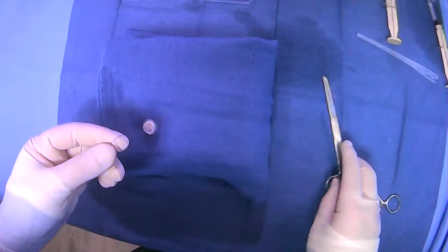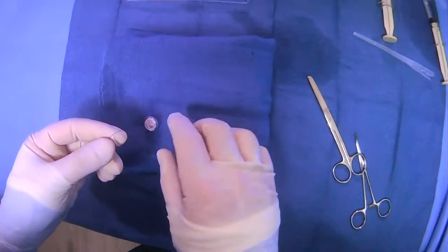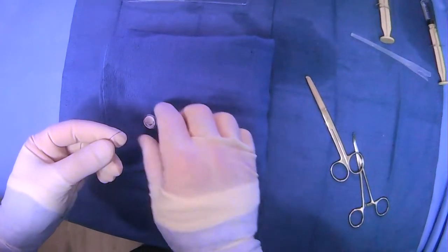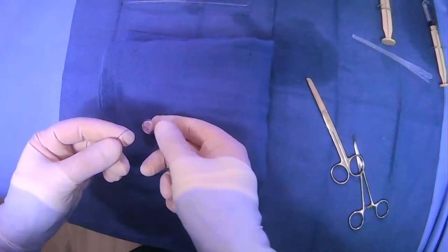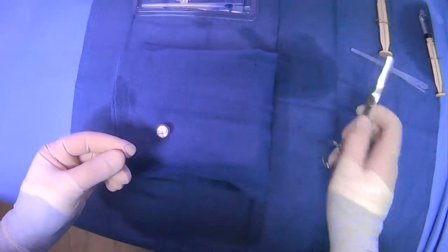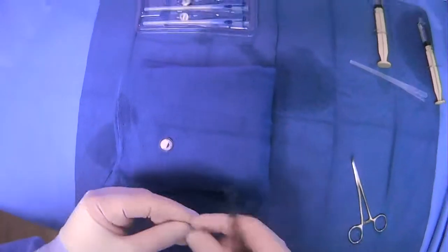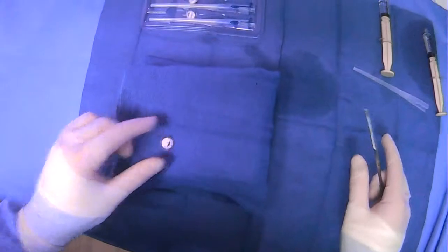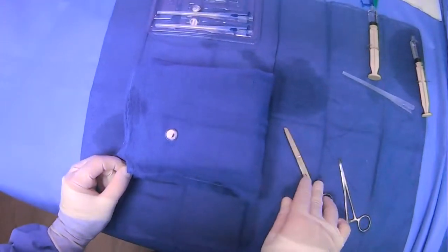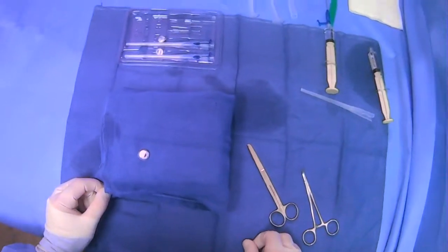Depending on the circumstance, you may tighten it a little bit more or a little bit less. But usually having a finger breadth underneath is helpful to make sure that you don't have issues. But then you can cut here, and now this fastener will kind of hold things in place. And that's how to use the T-Fastener system.